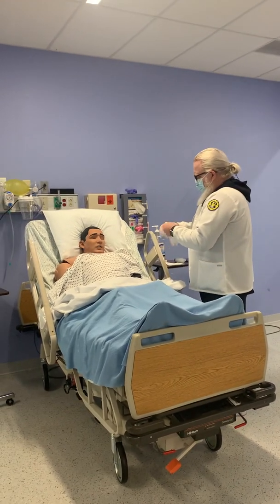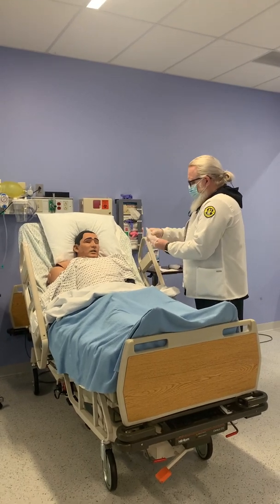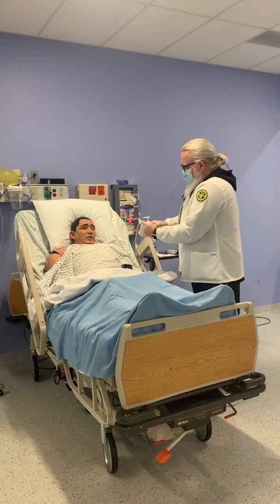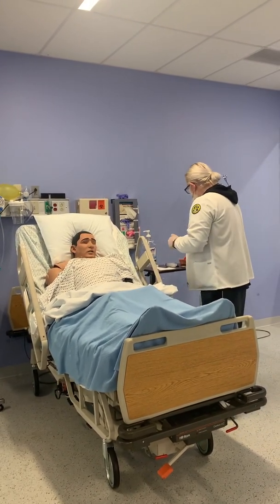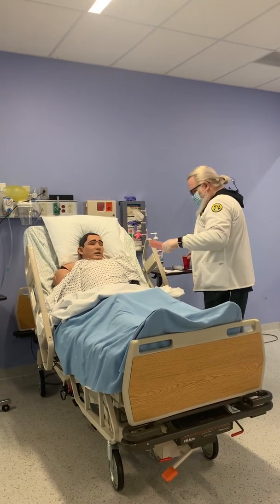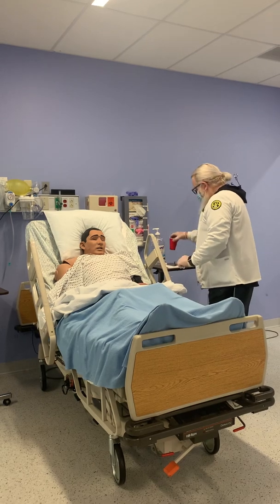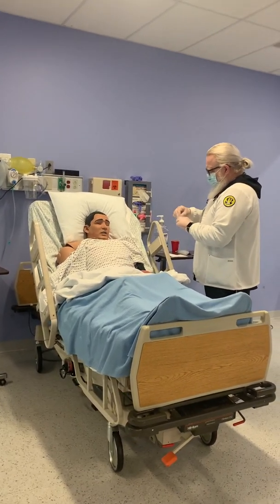So do you have any questions before we begin? There'll be some discomfort, but there won't be any pain, and we'll be as careful as we can, okay? All right, good. The first thing I'm going to do is put an emesis basin here, in case you do feel nauseous at all. I have a glass of water. I'm also going to get my tape ready so we can secure it once we have it in place.